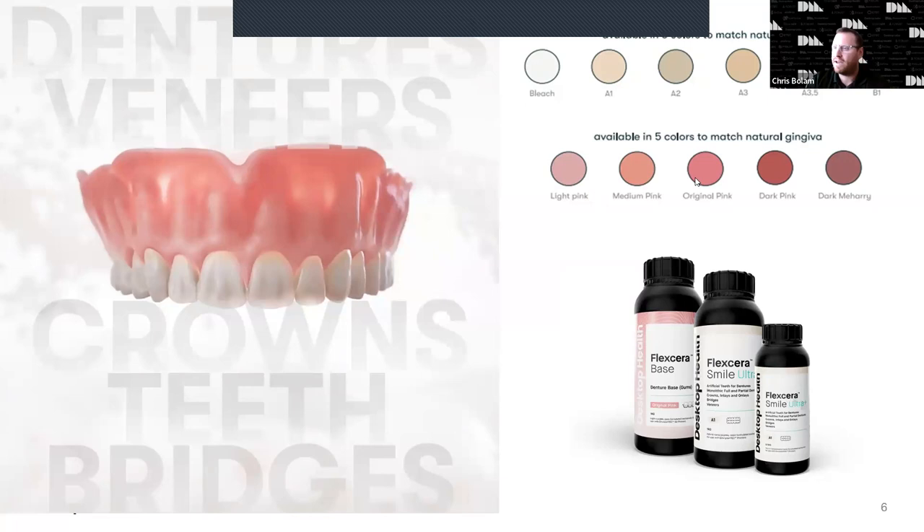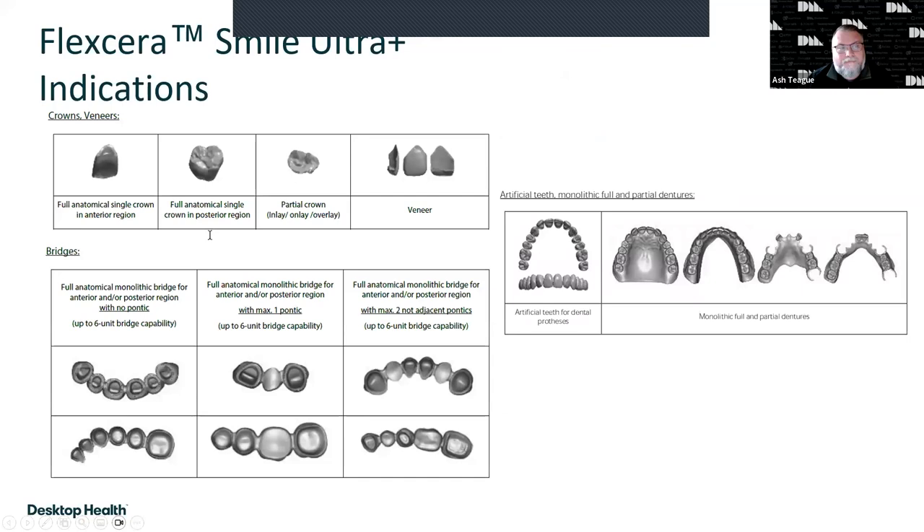Flexera Smile Ultra Plus has FDA approval for full crowns — both permanent and temporary — for anterior and posterior. It's also approved for inlays, onlays, overlays, and veneers. For bridges, you can do up to six-unit bridges splinted with no pontics, or a six-unit bridge with one pontic. The pontics cannot be adjacent to each other. We also have approval for denture teeth, monolithic monoblock dentures, and partial dentures.